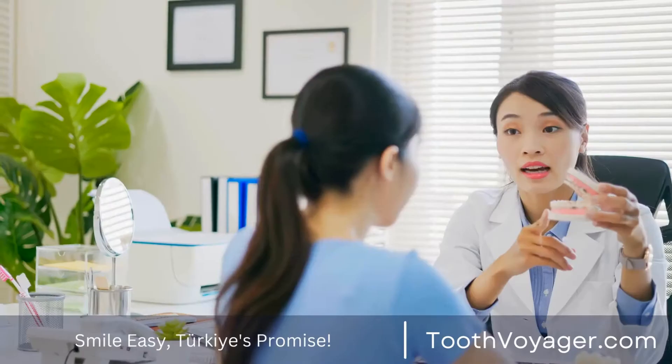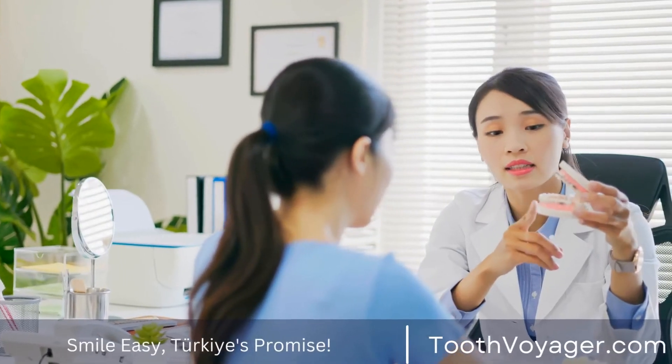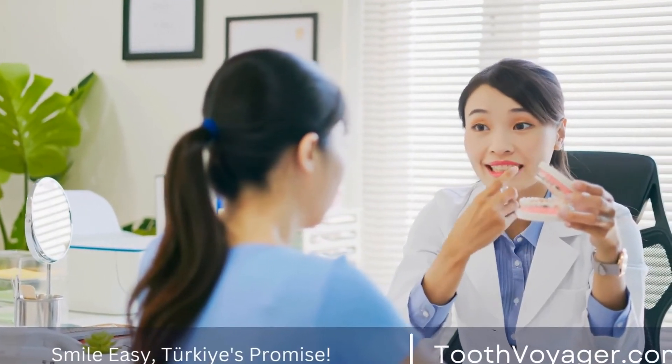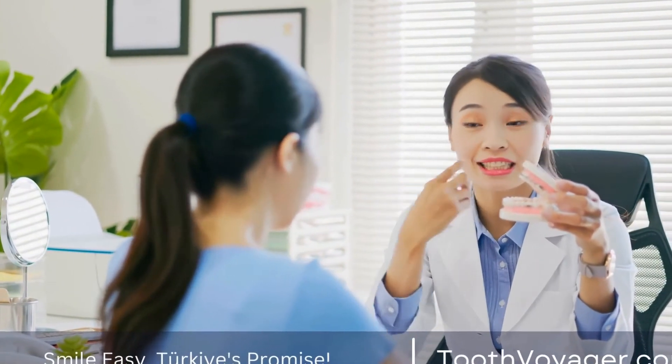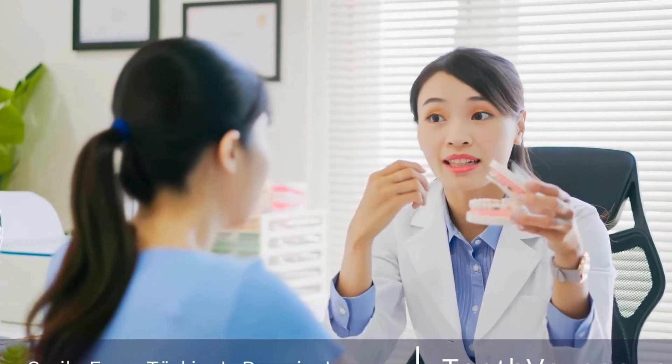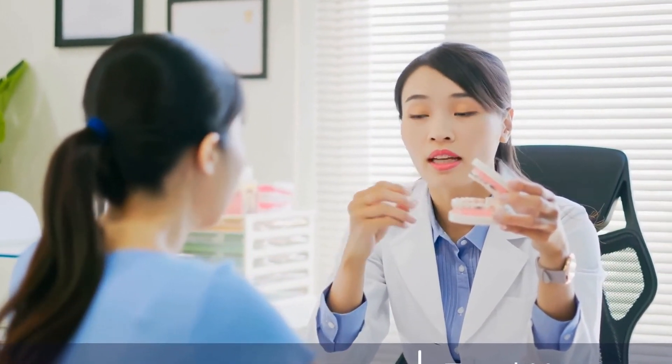Step 4 — Cleaning the canals: Using special instruments, the dentist will remove the infected or inflamed pulp from the root canals and clean out any debris.